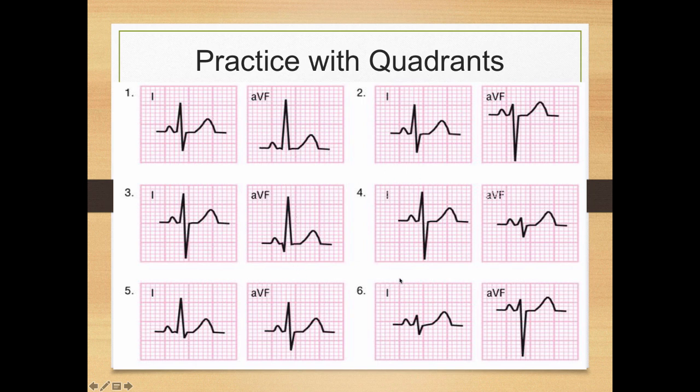Example 4, same complex, the same lead 1 complex as example 3, so a little bit more negative. And then we look at AVF, and there's some positivity and there's some negativity to that. So is it a little bit more positive? Is it a little bit more negative?